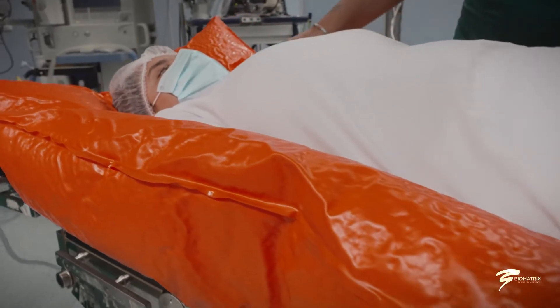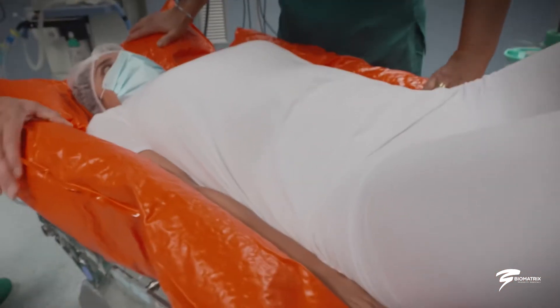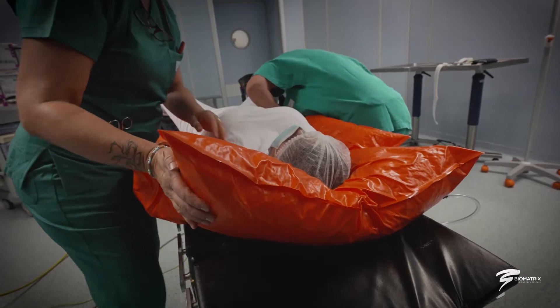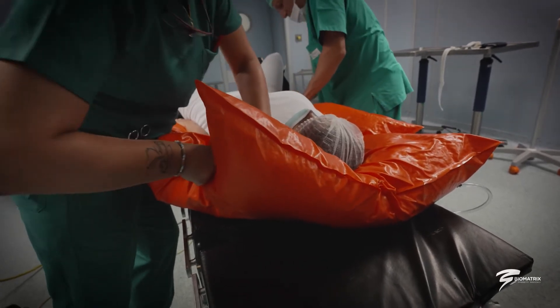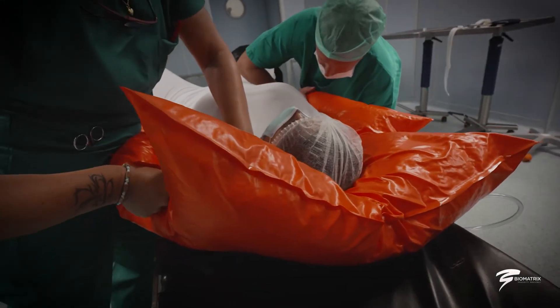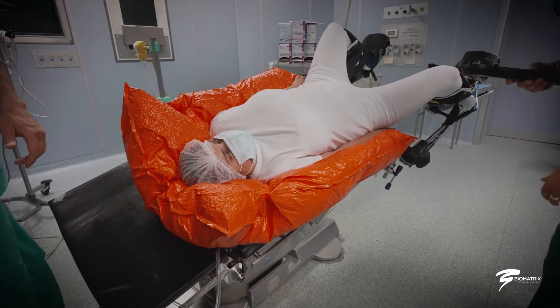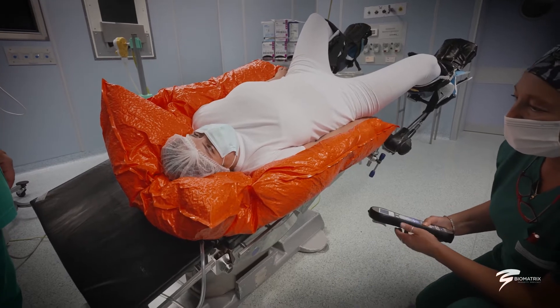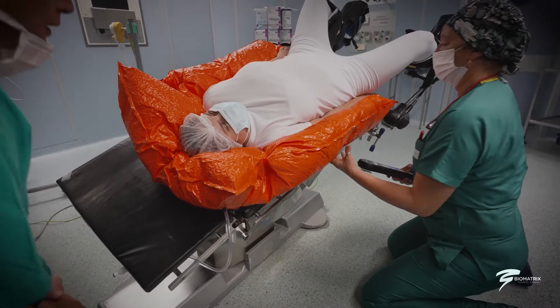It is ideal for exposing particular anatomical areas not reachable in conventional postures such as supine or lateral. The external part is composed of a mix of PVC and polyurethane, characterized by a velvety effect in contact with the patient, which gives comfort and prevents the onset of any irritation or skin lesion.